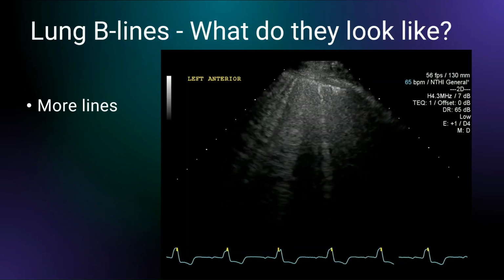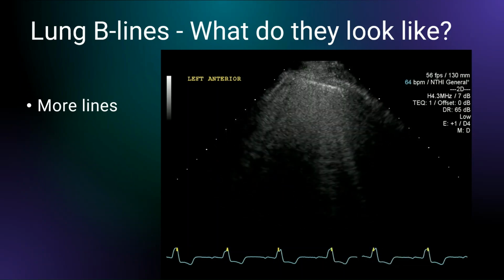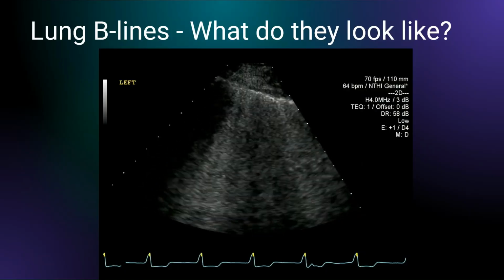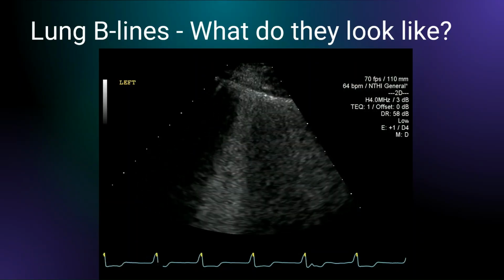Now they're starting to appear a lot more dense in comparison, so this one's more positive than the previous image. And again, just a few more here around there. They come and go with the breathing, but you can see these definite artifacts that appear.